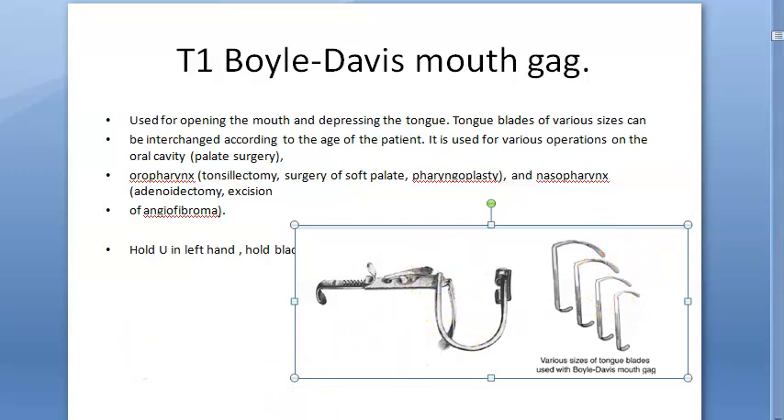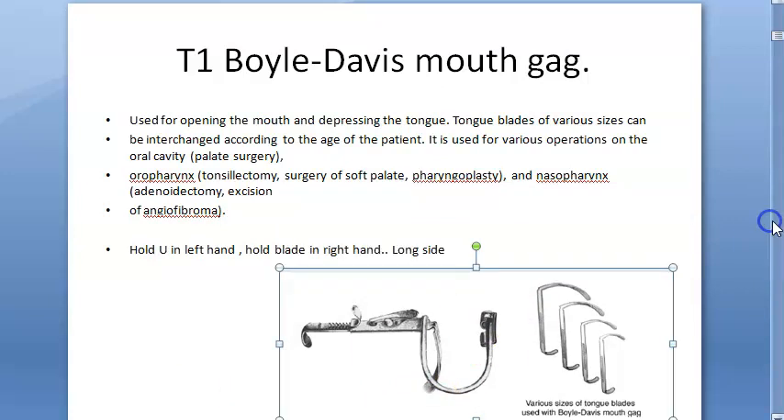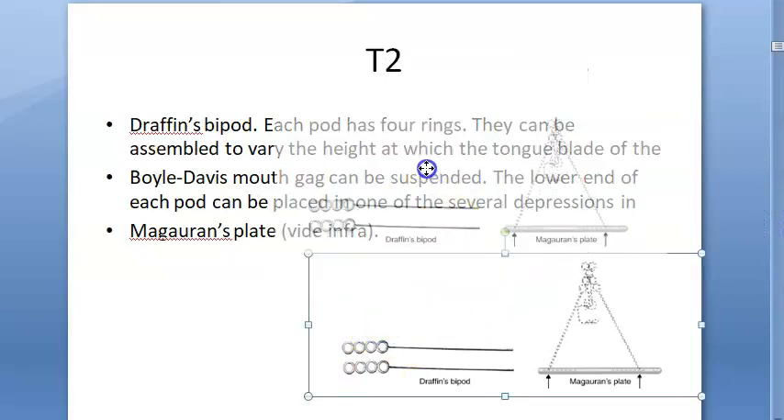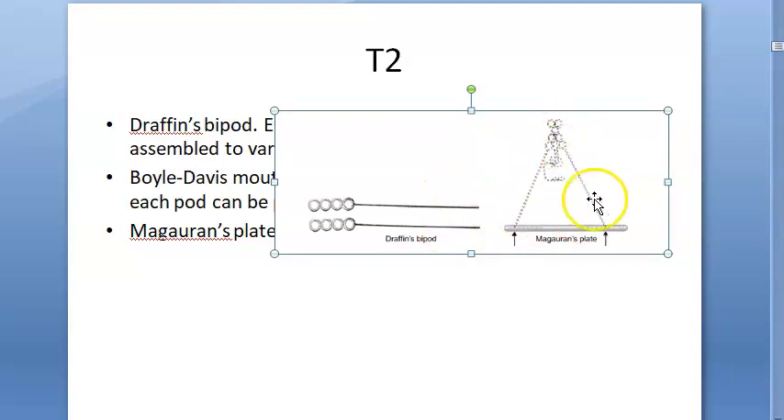This part here protects the patient's upper teeth. Then we will look at the Draffin's bipod — you can see the Draffin's bipod here. It stands on support provided by the Magauran's plate. You should know this.